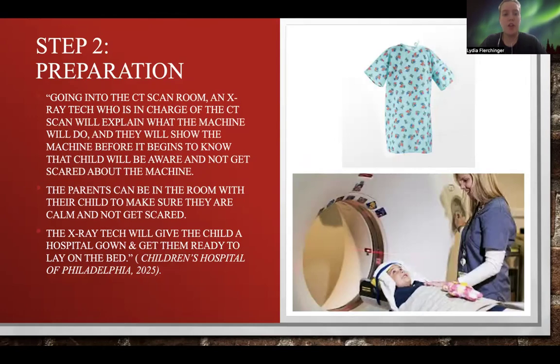And then you're going to put on a hospital gown, which looks like the one up in the picture. And also your parents can be there too. And also making sure that you're just lying comfortable and you're being still.